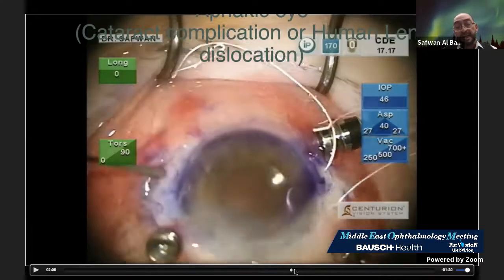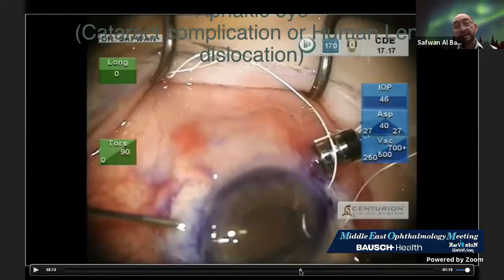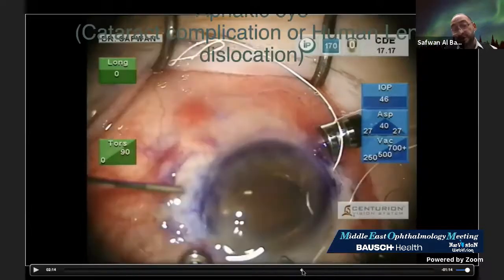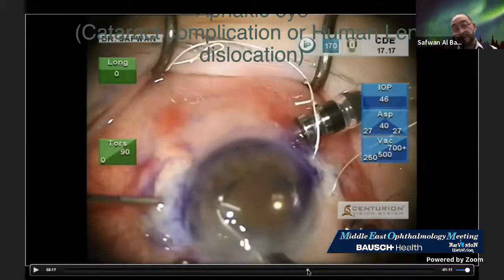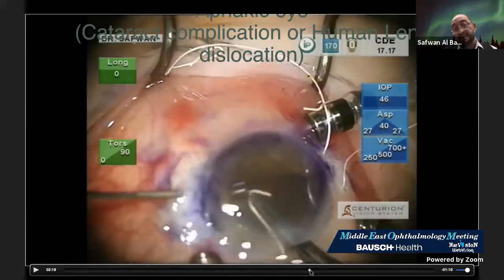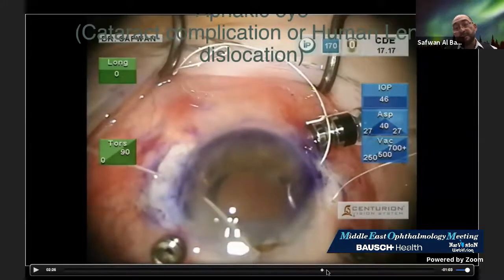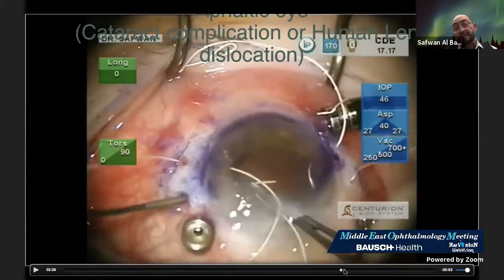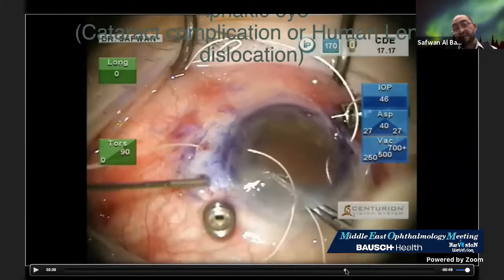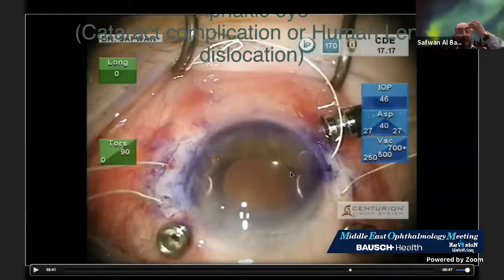And again, the first suture should be taken, the tying forceps through the eyelets, and then grasping the suture, the tip will appear. Now, yes, it's grasping the suture. This is the first one outside, and then we will go to the second, and then through the other eyelets, taking the suture out, externalizing it, and we have another loop. Now, we have two loops here, and the four eyelets over the iris.